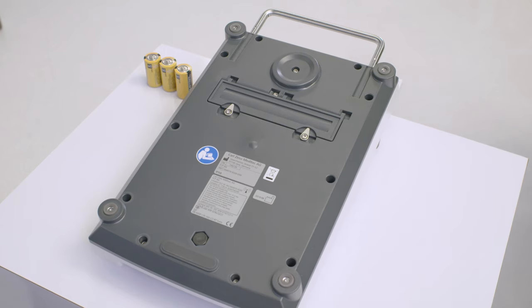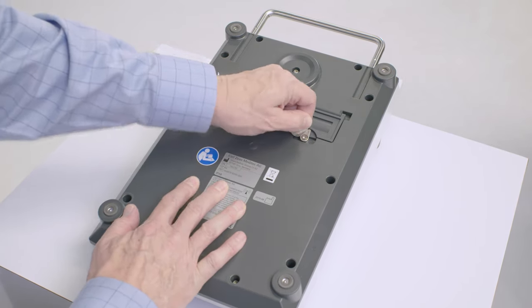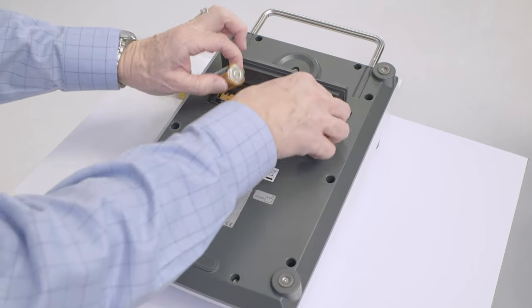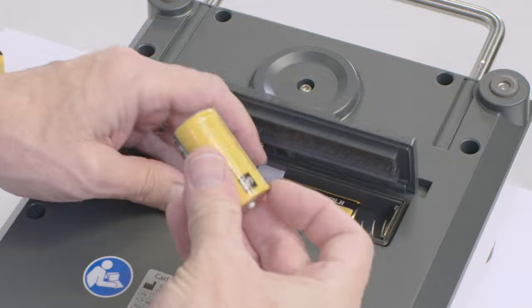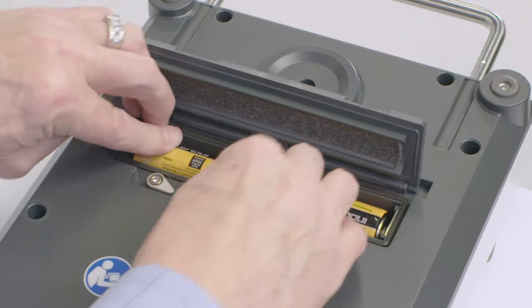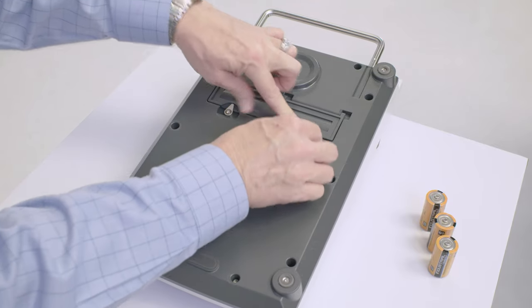To replace batteries, turn the foot control panel over and then turn the two locks on the battery compartment from their 12 o'clock positions to 3 o'clock. Open the cover of the battery compartment and remove the batteries. Follow the polarity shown on the bottom of the compartment and insert three new C-type alkaline batteries. Do not use rechargeable batteries. Replace the compartment cover and turn the locks back to their 12 o'clock positions.